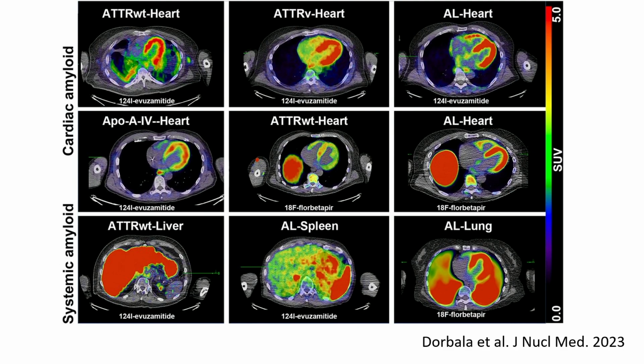Again, this is a radiotracer that's a PET radiotracer, but binds to any type of amyloid. And what you can see here is just different examples of uptake, either in patients with wild type or hereditary ATTR, as well as AL cardiac amyloidosis. And you can see that, again, it really just shows where the uptake is. So it's a way to detect any type of amyloid, which is, again, something that might be relevant and potentially a way to get away from biopsying all of these patients.